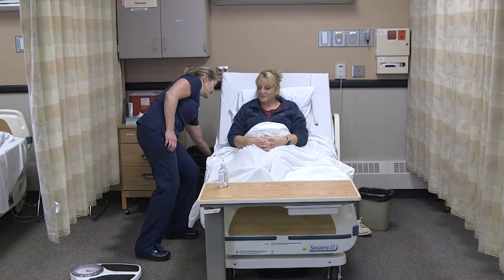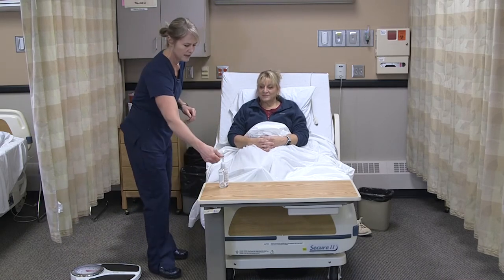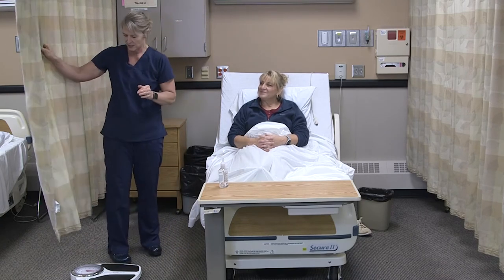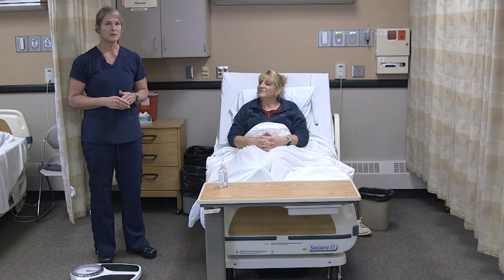I see you have your call light there. Make sure the bed's all the way down and locked. Anything else I can get for you? I'm going to open up your curtain again. Then I'll document the weight in either pounds or kilograms and report to the nurse if there's any fluctuation of more than three pounds from the day before, or a fluctuation of five pounds within the week.